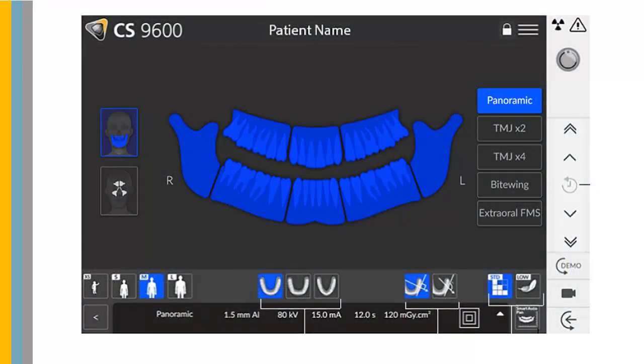The Touchscreen Control Panel is an alphanumeric digital soft-touch console. It allows you to interact directly with the unit to carry out panoramic and 3D functions.